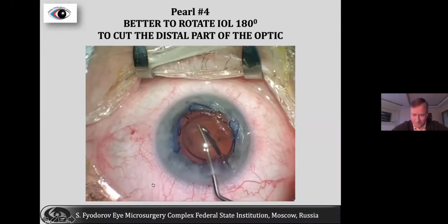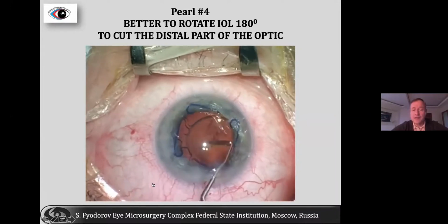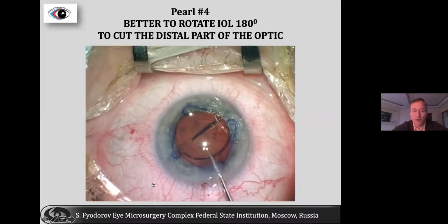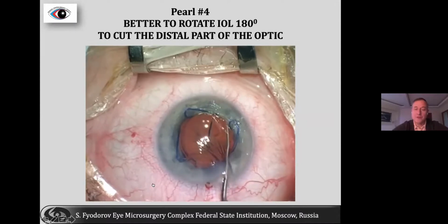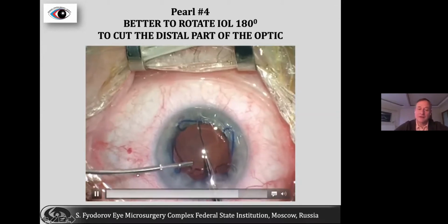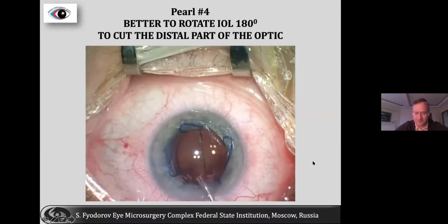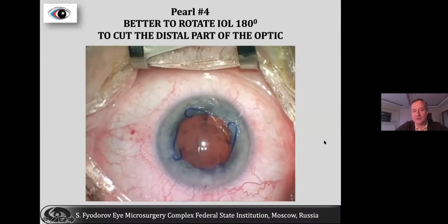So this is a pupil expansion ring, which is not a problem in that case, because you can place the IOL on top of the iris, and then, which is important here, rotate the lens and cut the lens close to the main incision, which allows you to prevent cutting the capsule on the distal end of that optical element. And then the procedure becomes more or less routine. You implant the next lens and you are done.